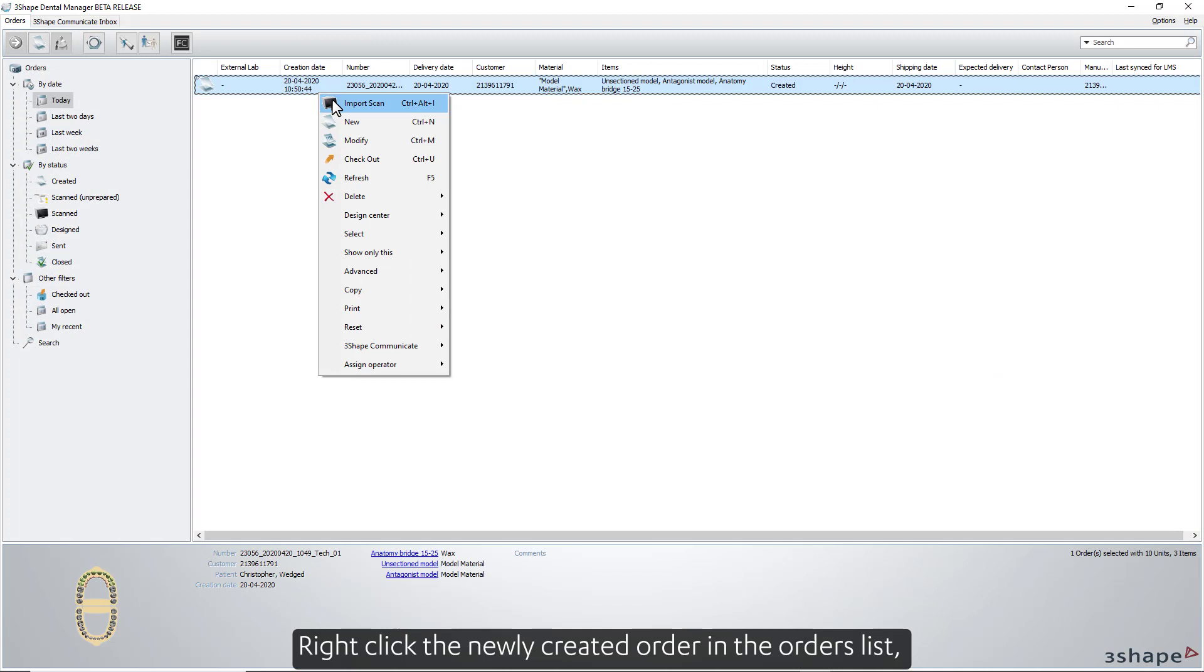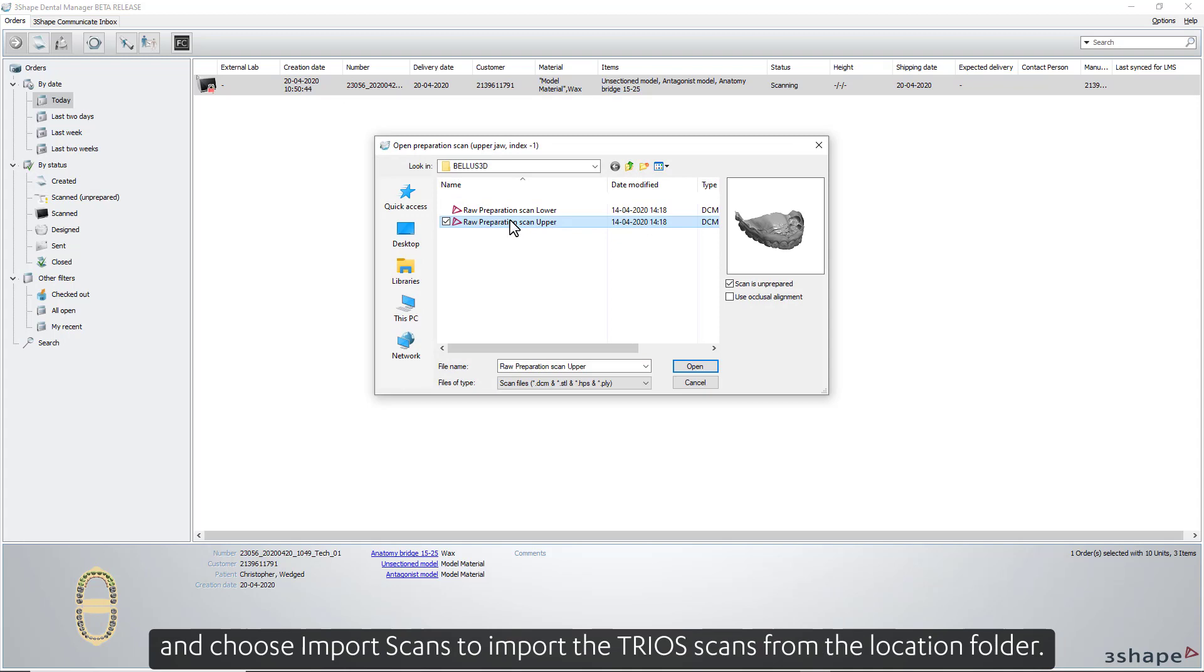Right-click the newly created order in the orders list and choose Import Scans to import the TRIOS scans from the location folder.